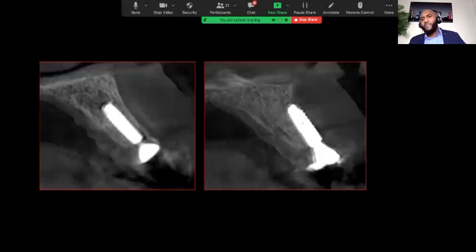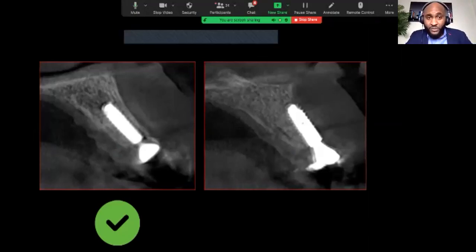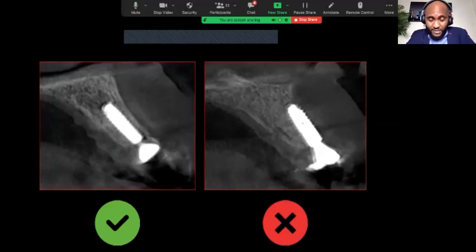Now, that means that cone beam CTs will actually be a very good tool for you to evaluate and plan in advance, anticipate problems. Look at those two. You'll be lucky if you did not do a cone beam CT, placed an implant, and yes, you end up with at least bone surrounding your implant. But it is also a possibility that you can actually completely miss it. And Dr. Tom Tiable once told me, without a cone beam CT, you're guessing. I now agree.